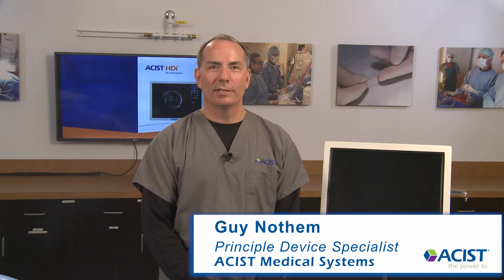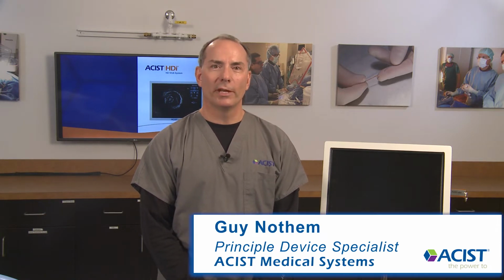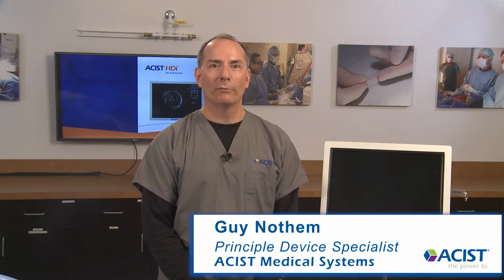The ACIST HDI system is intended to be used for the intravascular ultrasound imaging assessment of coronary and peripheral artery disease. The ACIST Kodama intravascular ultrasound catheter is intended for ultrasound examination of coronary and peripheral intravascular pathology. Intravascular ultrasound imaging is indicated in patients who are candidates for transluminal coronary interventional procedures.